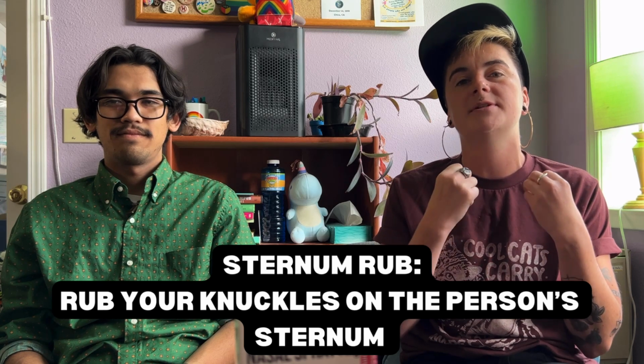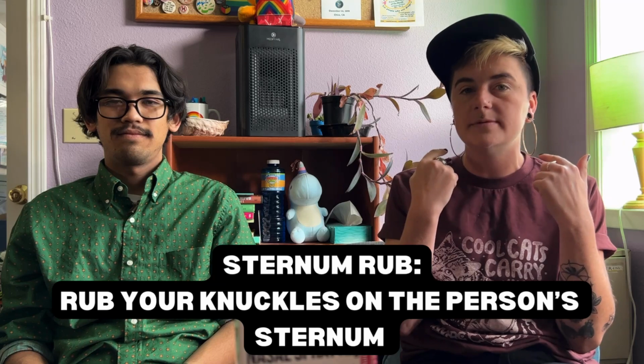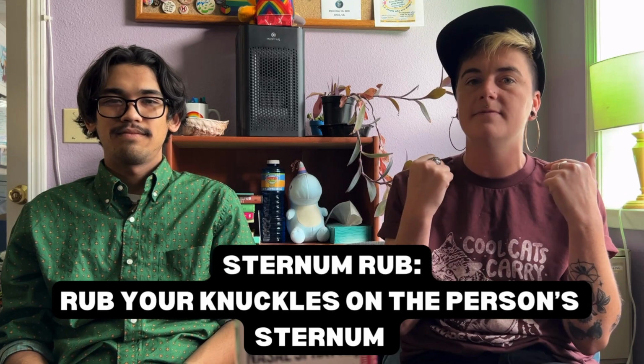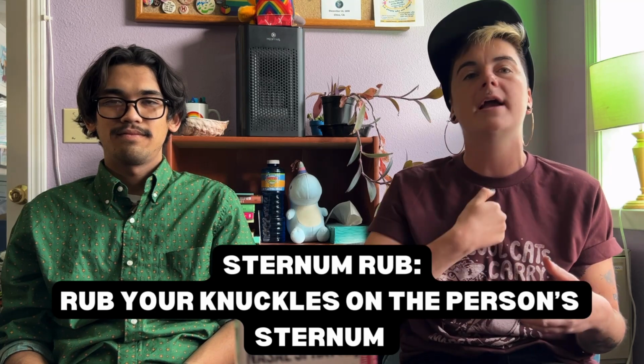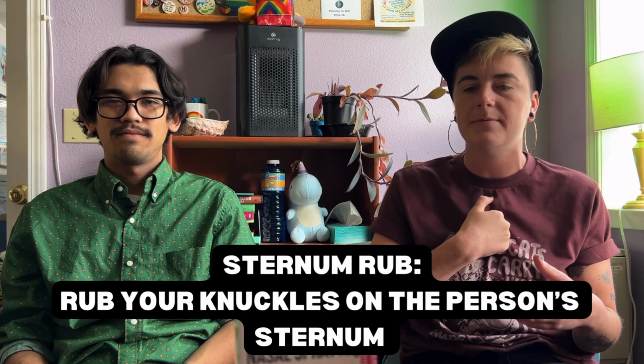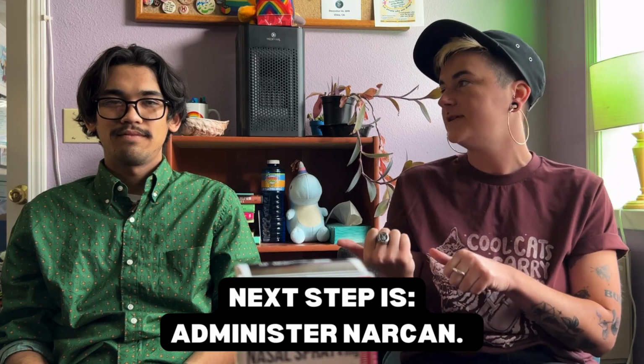And again, remember to narrate what you're doing. Even if that person's unresponsive, they might be able to hear you, they might be processing some of that information, even if they can't speak. So just say, hey, I'm trying to wake you up, I'm going to touch your chest and try to wake you up that way. If they continue to not wake up, next up is administer Narcan.